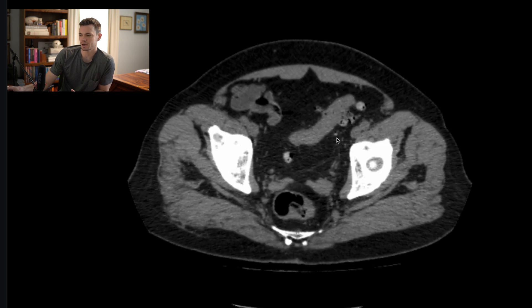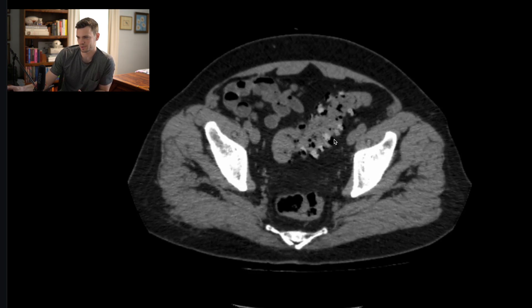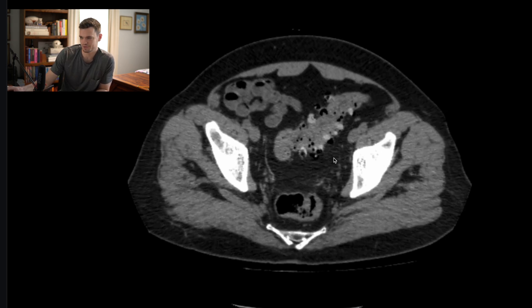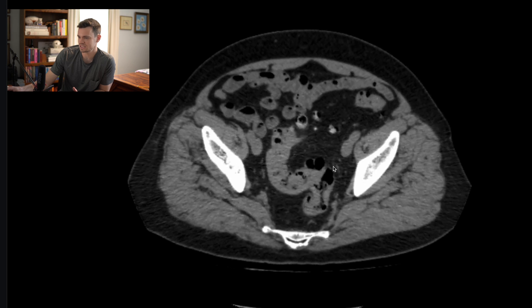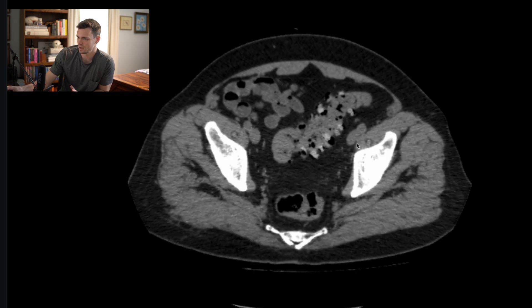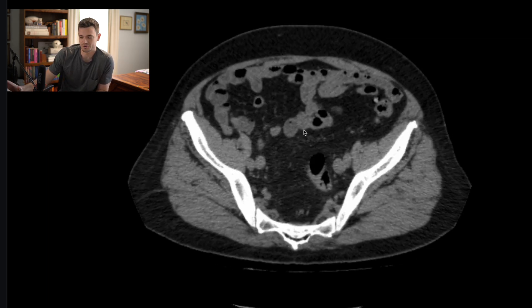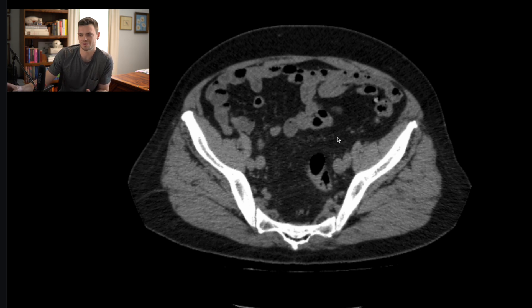Diverticulosis is a very common cause of painless gastrointestinal bleeding. If you have a patient that comes in with painless GI bleeding, diverticulosis should be towards the top of your differential diagnosis. This patient has pretty extensive diverticulosis — as I'm outlining the colonic wall, there are lots of tiny outpouchings, and these are all diverticulae. This is diverticulosis without diverticulitis — very, very common. You see it all the time; it's just an incidental finding on a patient being scanned for another reason.